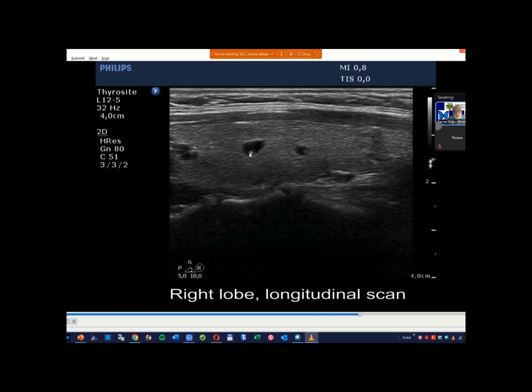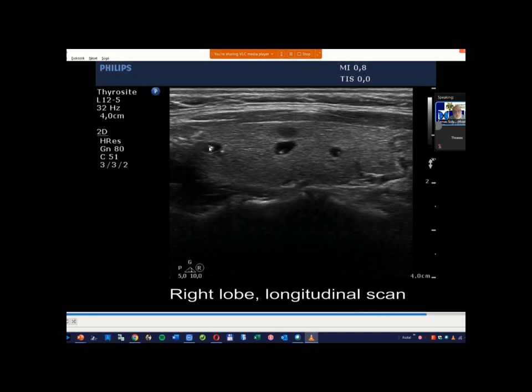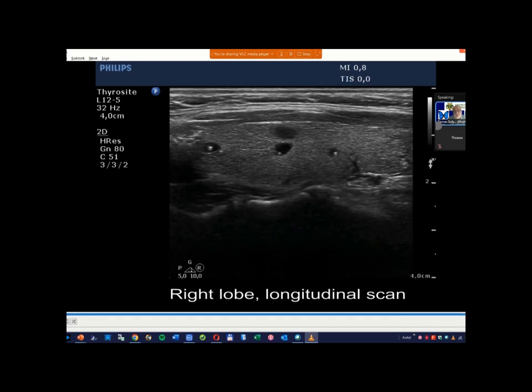So this is a reverberating artifact. Here is the primary focus, the colloid crystal, and here is a dorsal narrowing tail. I will present some cases with enlargement, but usually we do not do that. Here is another typical form. Colloid crystal in a cystic fluid and the dorsal fading and narrowing tail with a quite triangular form. So this is the typical presentation of comet tail artifact.